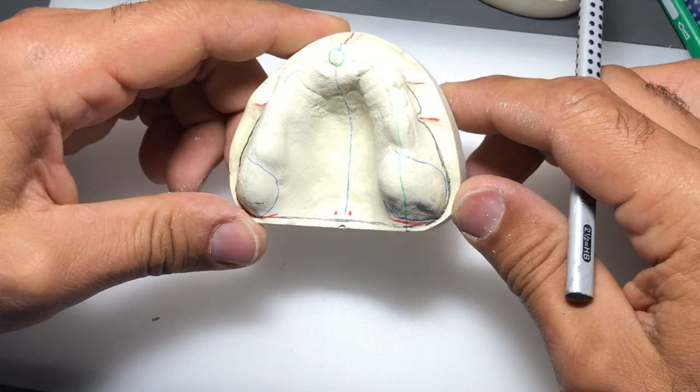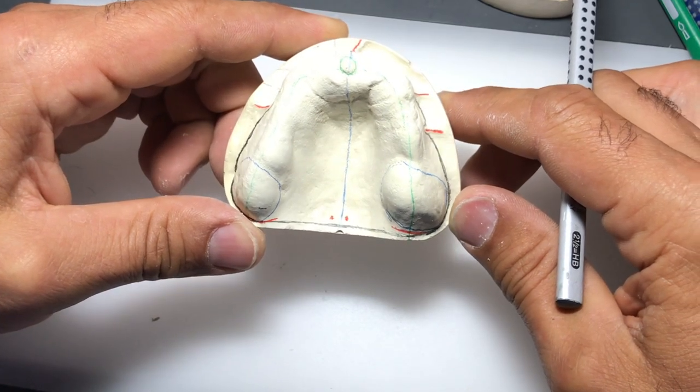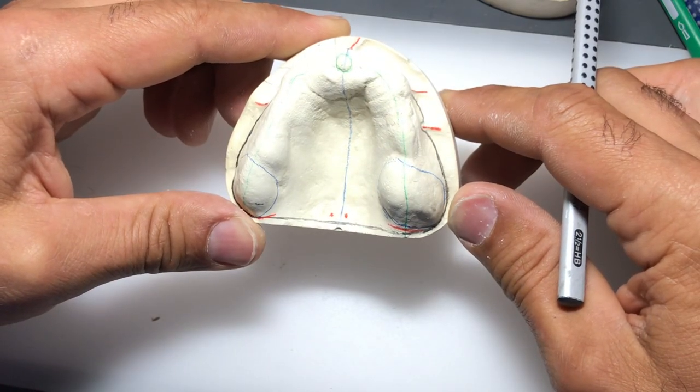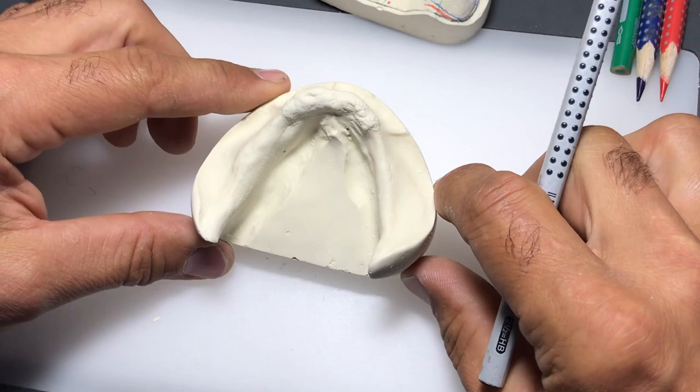Any imperfections you might have with your custom trays you can compensate with your final impression during border molding. To recap: we have our midline, incisive papilla, crest of the ridge, maxillary tuberosities, palatine foveae, and of course the outline of the attached and detached gingiva where we're going to finish our custom tray.